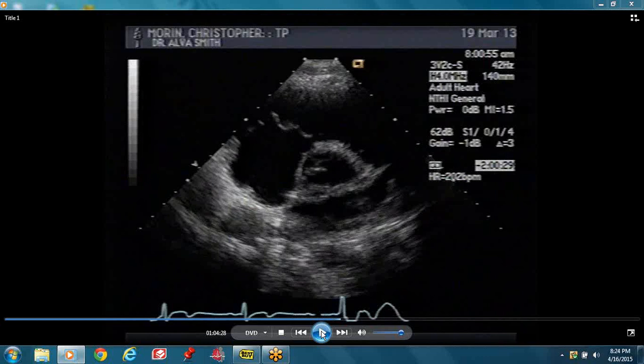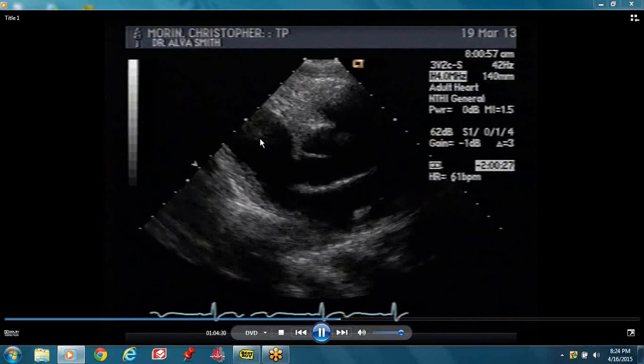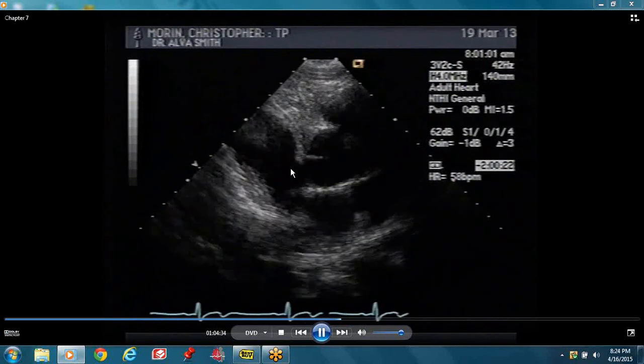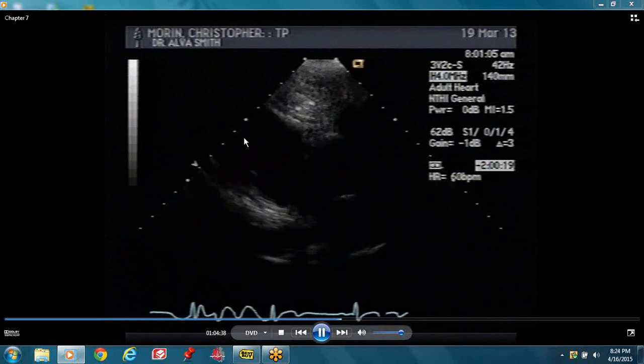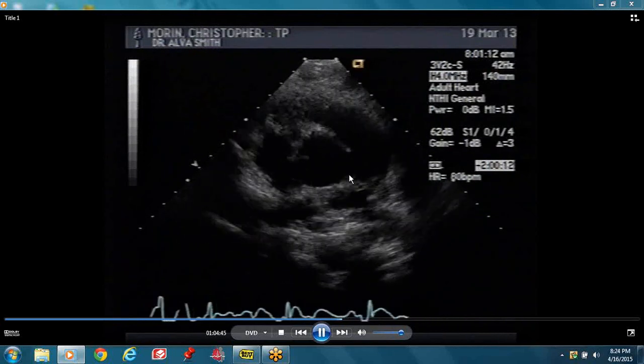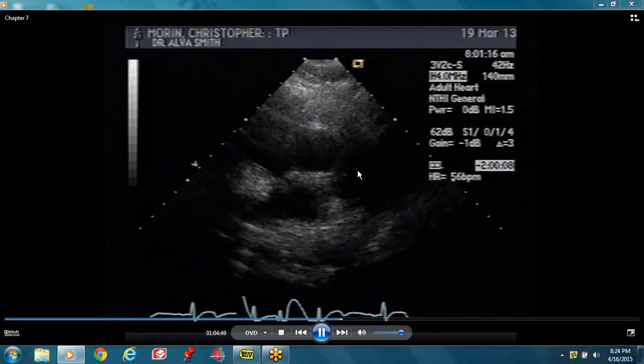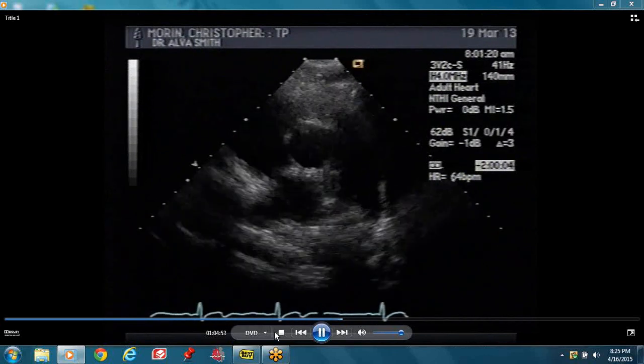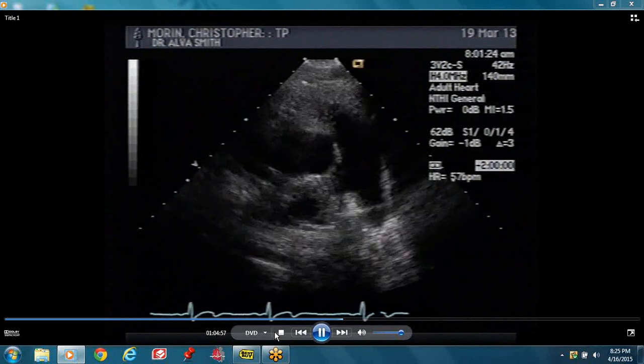You have to look at the aortic valve when it's open. If it's tricuspid, it will open in a triangular configuration. If it's bicuspid, it opens in a football configuration. This is our tricuspid valve over here. In this view you can see the septal leaflet and your anterior leaflet. The pulmonic valve is right there, the main pulmonary trunk splits to the right and the left.